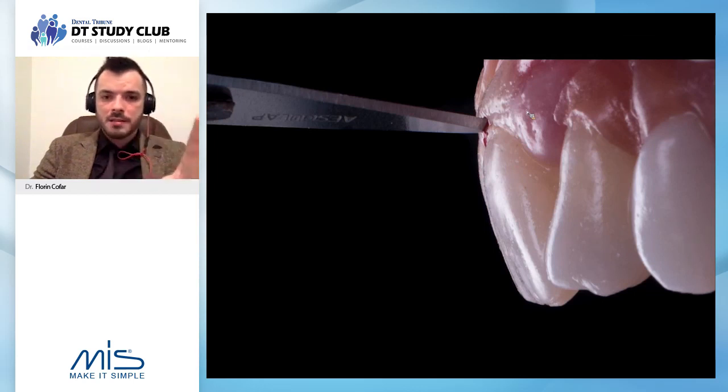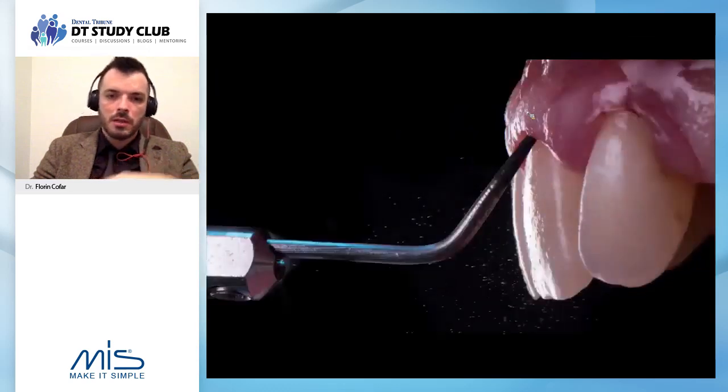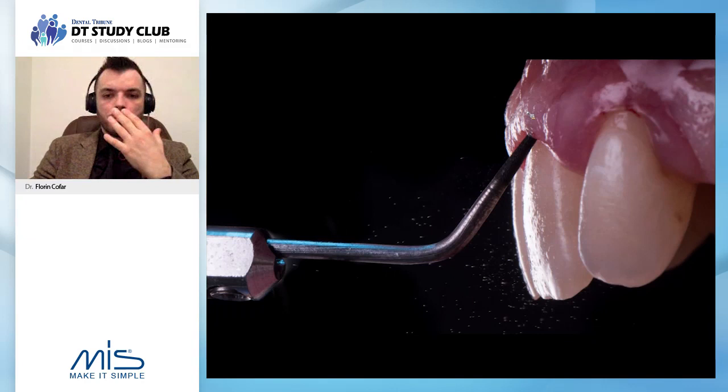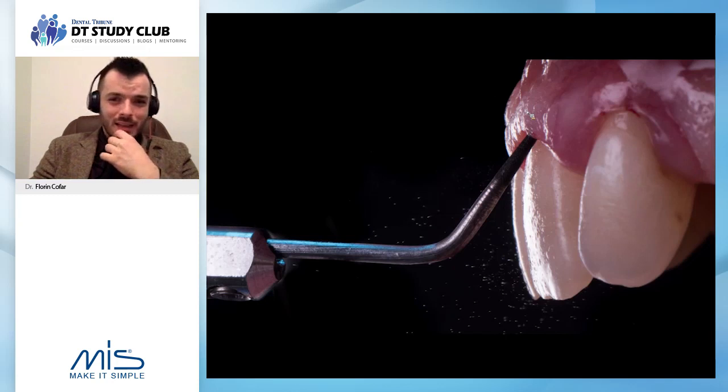Now, in this case, the mock-up is actually the surgical guide for the tissue reduction, so we're simply going to cut around it, and then in cases where bone is not too bulky, we can perform a flapless bone surgery. This is a very nice diamond tip from CV Dentis, Brazil.